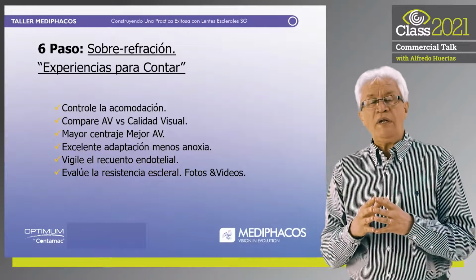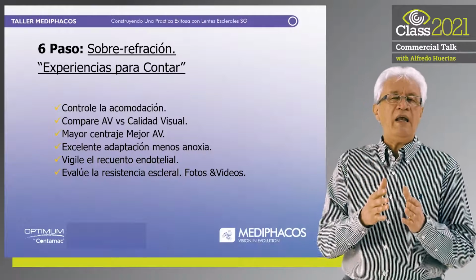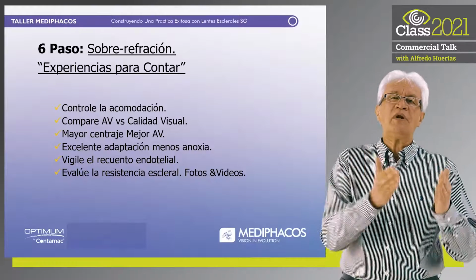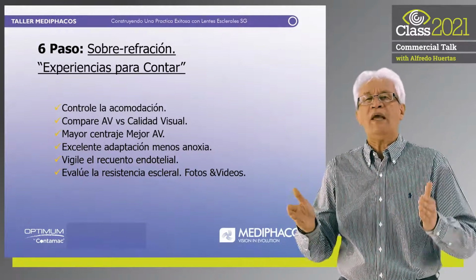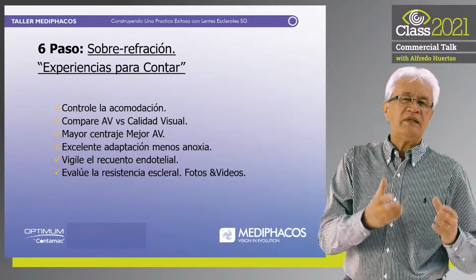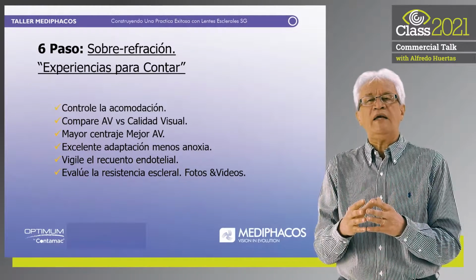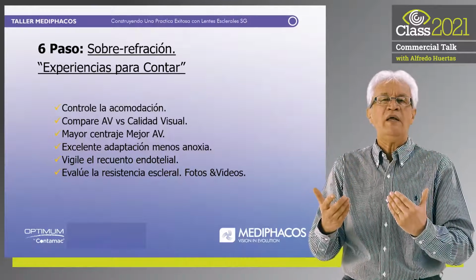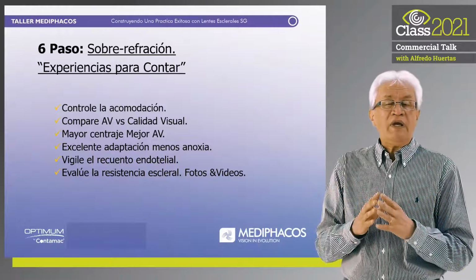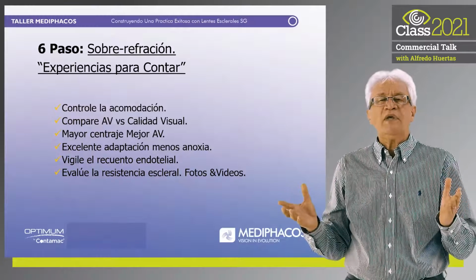It is important to monitor the endothelial count year after year when the patient goes to their consultation. And when using scleral lenses, it is mandatory in those patients, even with refractive surgeries or keratoplasties, etc. We should try to not be, quote-unquote, heroes, but also achieving visual acuity, and that at any moment there is a corneal decompensation.